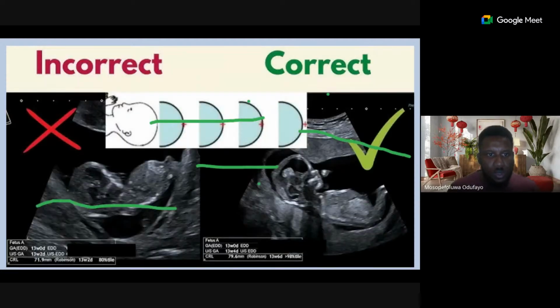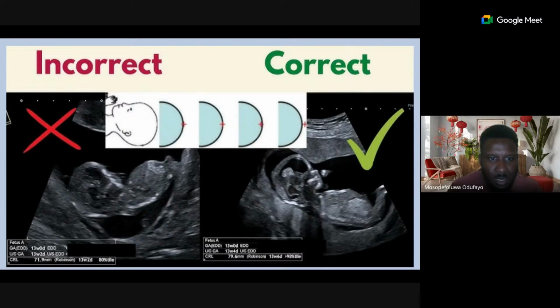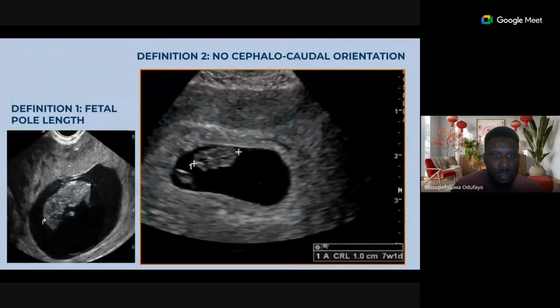Let's move. So now this is an example of that wrong flexion I was talking about. See, the baby has flexed their neck here. We can't see it, so it makes this CRL a little bit short. Is that okay? And so this CRL is not good, this one here, while this one on this other end here is fantastic. Is that okay? Good. So now look at this one. Here we can see the head. We can tell that the head is around here. And then here we can tell the bum is here.